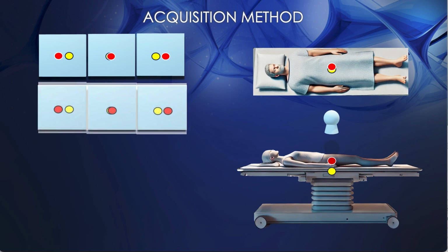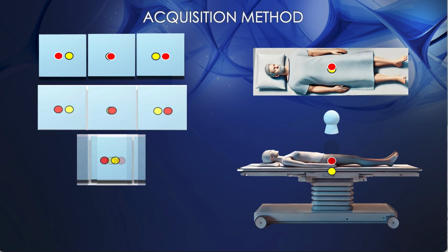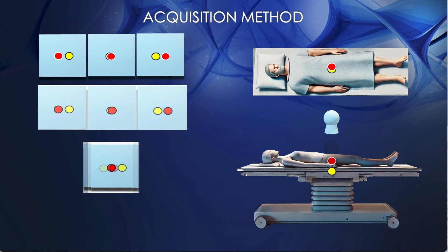Right? You can, of course, change the way you combine these so that instead of the yellow in the prior example, you actually have the red that is visible. And that's the magic of digital tomosynthesis, it's a bit like a limited angle CT. You get slices through the entire patient, but you do not completely remove the objects that are above and below the imaging plane. And those objects are often referred to as structural noise. So it gets blurred away, not entirely, but enough that the resulting images are quite useful.